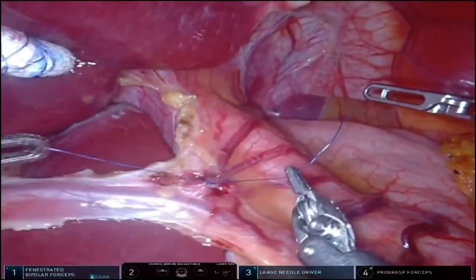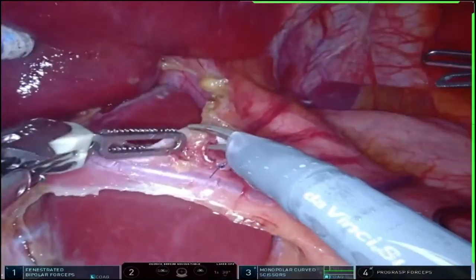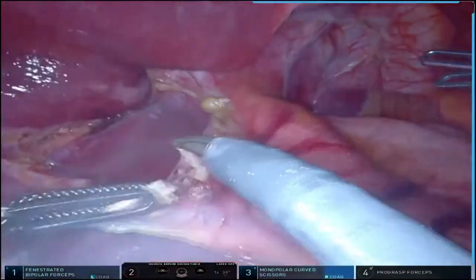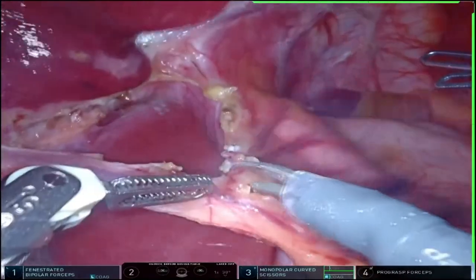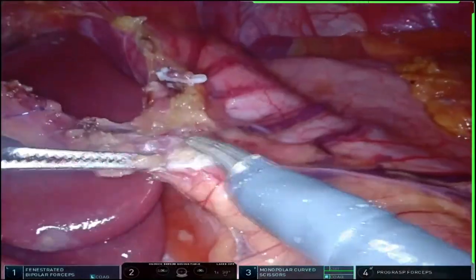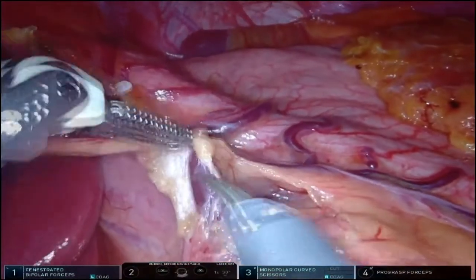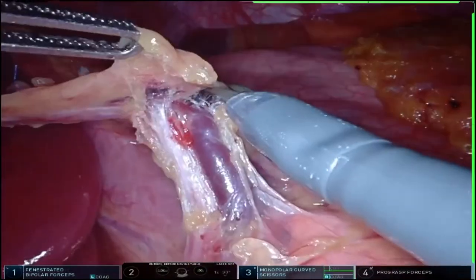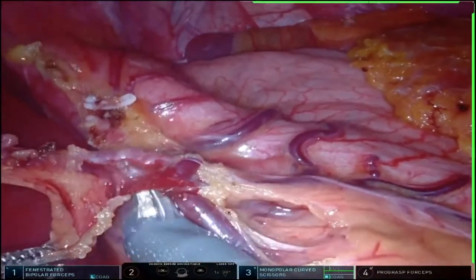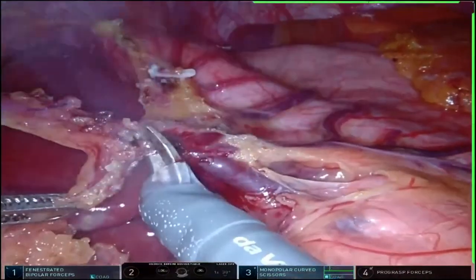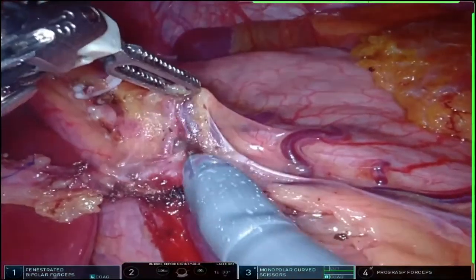This is the accessory left hepatic artery from the left gastric. You can see every one of the branches — you divide them or clip them. If they are small, a very detailed dissection can be done. This will take an additional 15 minutes, but this can be done even better than open surgery. In open surgery you end up with a lot of tissue around — you take the artery and the vein together and then clear it on the bench. Whereas with the robot, you can actually do most of the dissection inside, so the artery is absolutely clean.